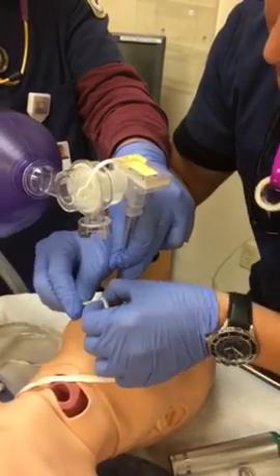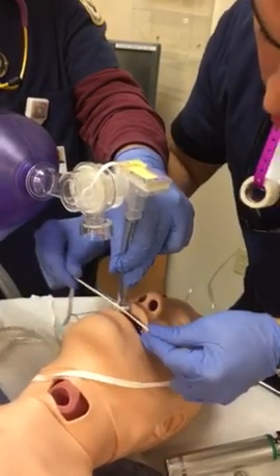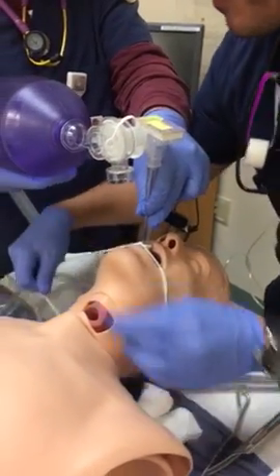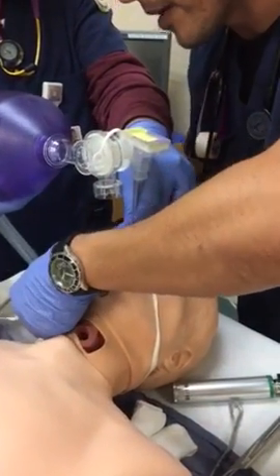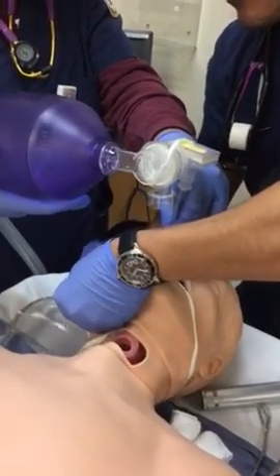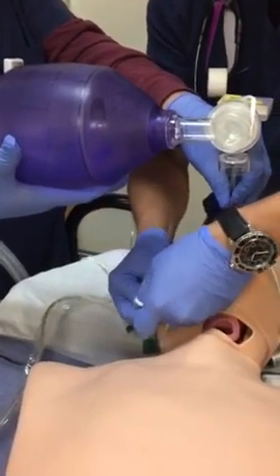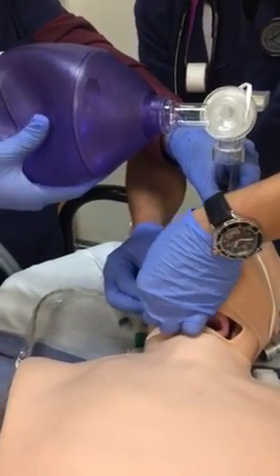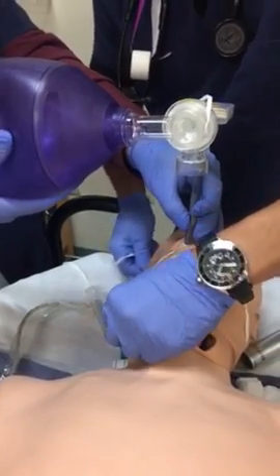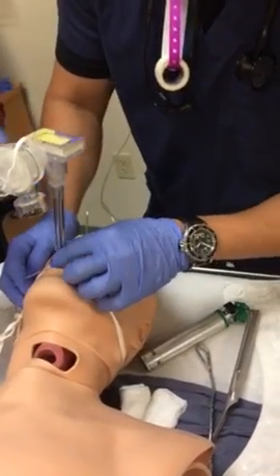These gloves are too big. Now we come around the neck, and we want to make sure that we keep the cuff and balloon away. We don't want to tie those up. So now the airway should be secure.